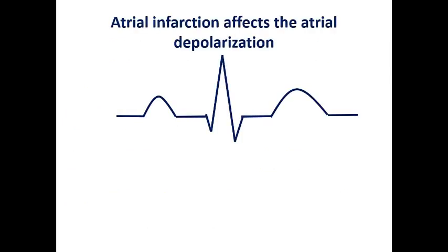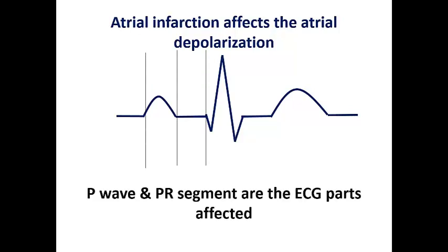Let's look at this ECG example. Atrial infarction results in infarction of the atrial myocardium, so by logic, the affected parts of the ECG would be the P wave — which represents atrial depolarization — followed by the PR segment. These are the parts of the ECG affected in atrial infarction, whereas the QRS complex, ST segment, and T wave are affected as a result of ventricular infarction, not atrial infarction.